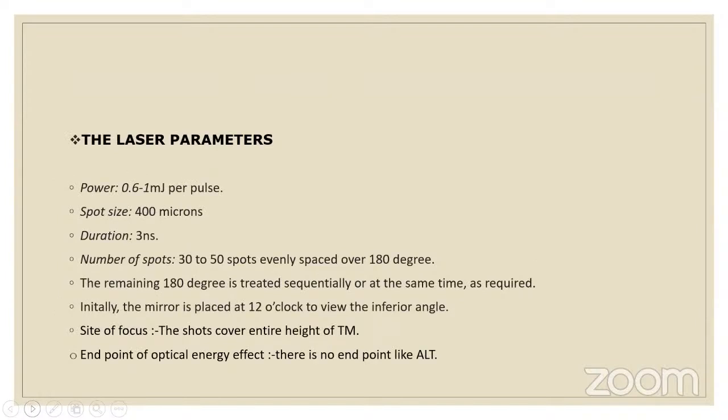That's big, and duration is 3 nanosecond. The number of spots is 30 to 50 spots over 180 degrees. The remaining 180 degrees is treated subsequently or at the same time. And the site of focus is the entire covering of the trabecular meshwork, and there is no endpoint like ALT.